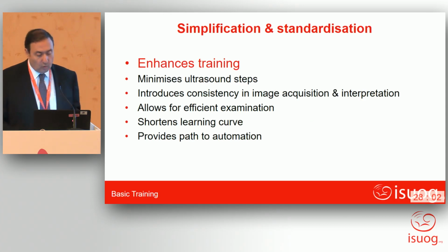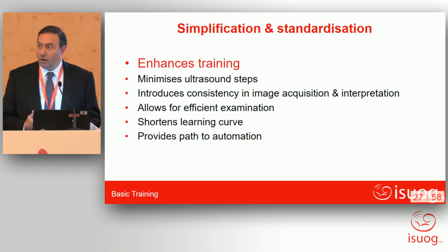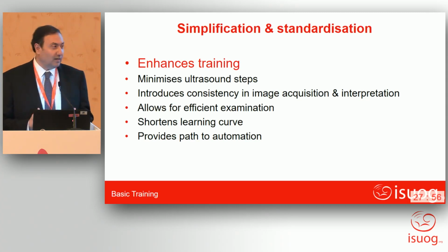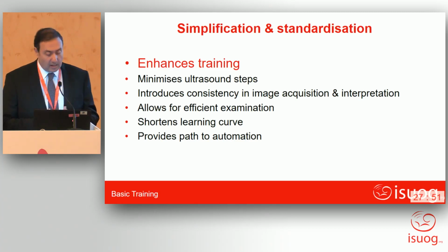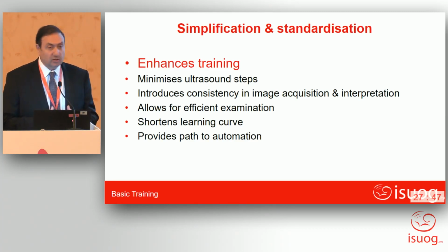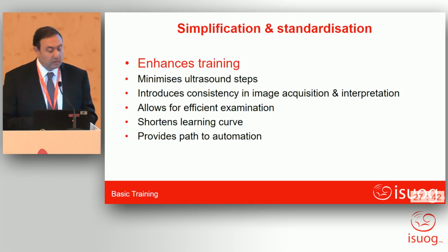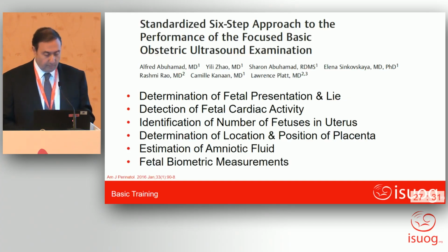So the more we simplify or standardize the ultrasound, the better we are able to obtain images that are displayed in the same format all the time, thus allowing us to complete the examination. Simplification enhances training, minimizes the ultrasound steps that need to be obtained, introduces consistency in how images are acquired, allows for efficient examination, shortens the learning curve for trainees, and provides a path to automation in the future.